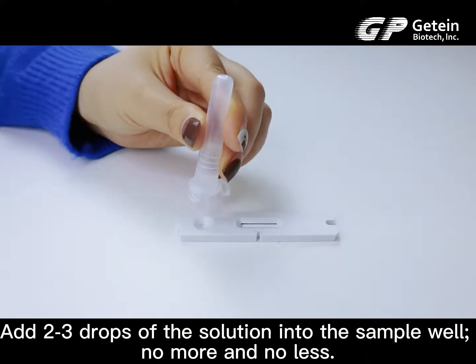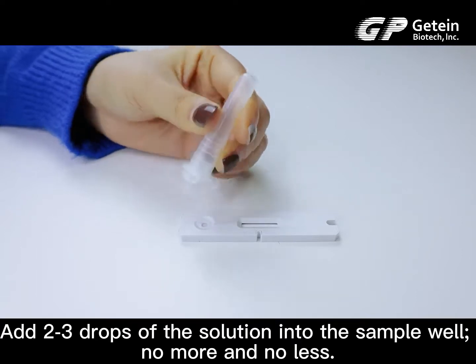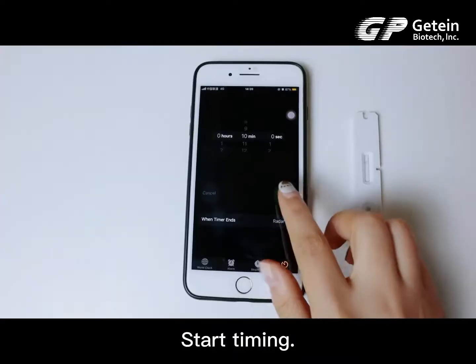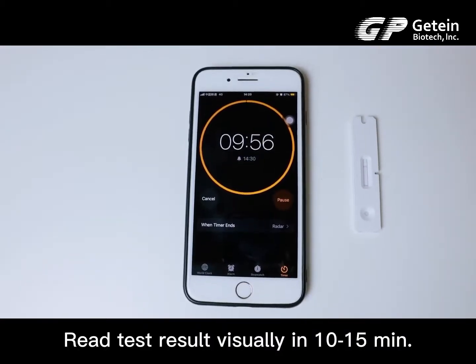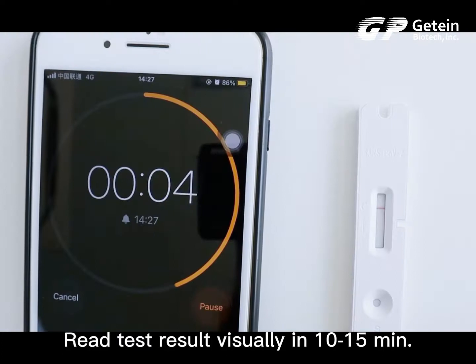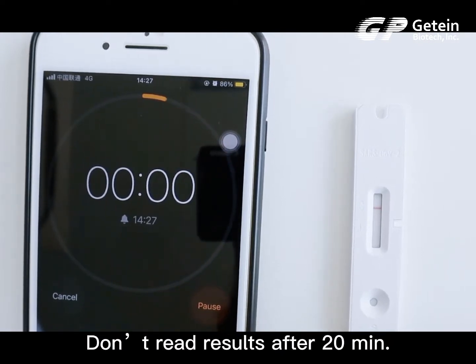Add 2 to 3 drops of the solution into the sample well — no more and no less. Start timing. Read test results visually in 10 to 15 minutes. Don't read results after 20 minutes.